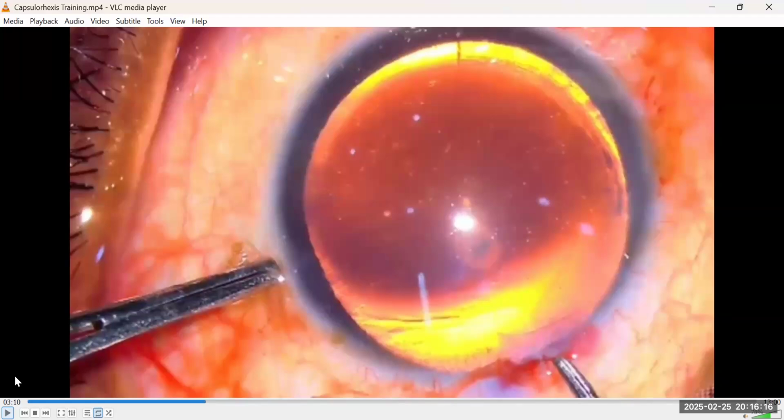So we now said, if my desired perimetry of the rhexis is about 5 millimeters of diameter, it's most likely going to fall into the mid-periphery of the cornea. Now, that also means that the surgical depth of the mid-periphery is lower than that of the center. You might have about 2.5, 2 millimeters of depth, and that will inform your choice of instrument. It's good to have a combination of instruments.